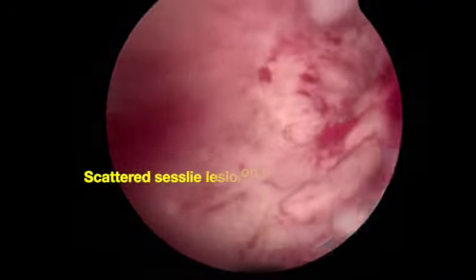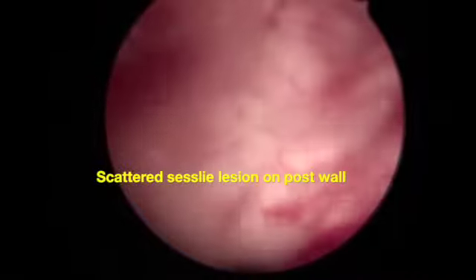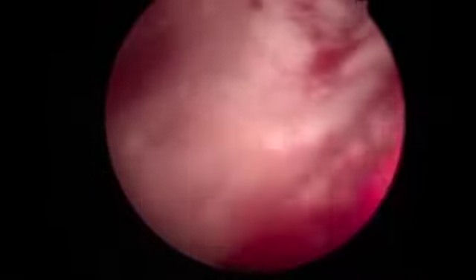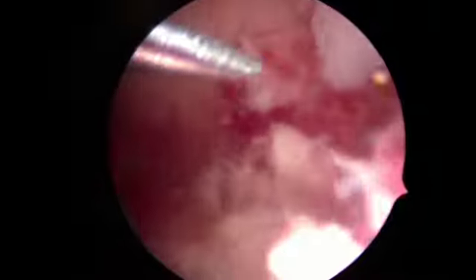Here, by going with the 5 French scissor on the posterior wall, we will now elevate these lesions so that we can take a proper biopsy or remove the entire lesion step by step. We align the scissors to the posterior wall, take bites along the posterior wall so as to elevate the tissue of the posterior wall.